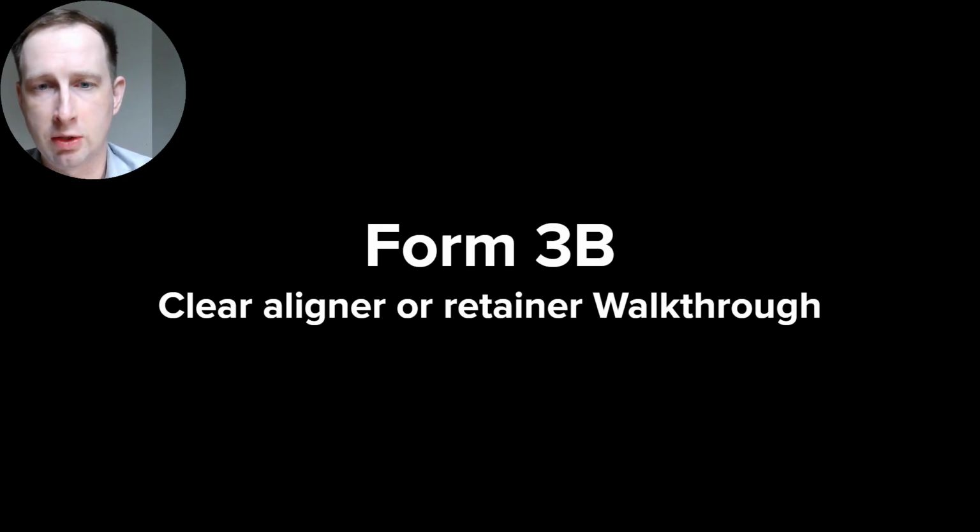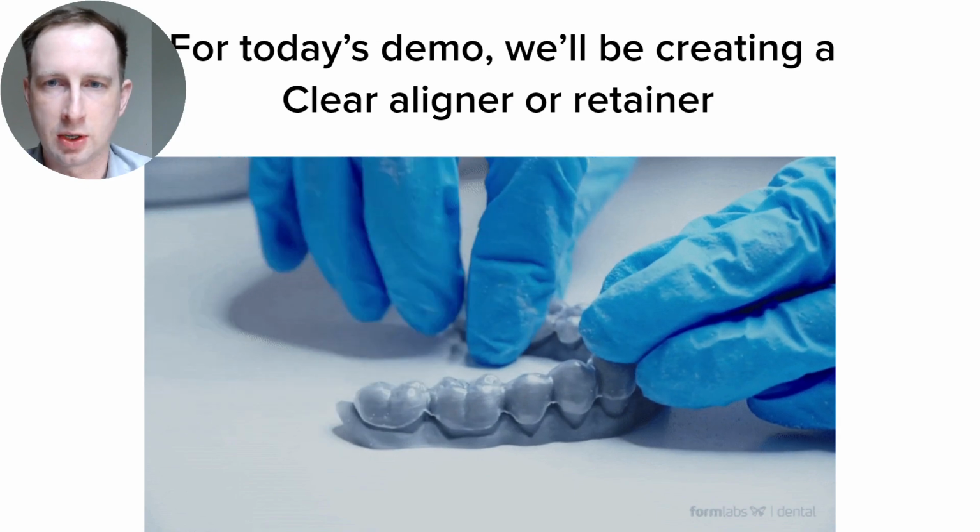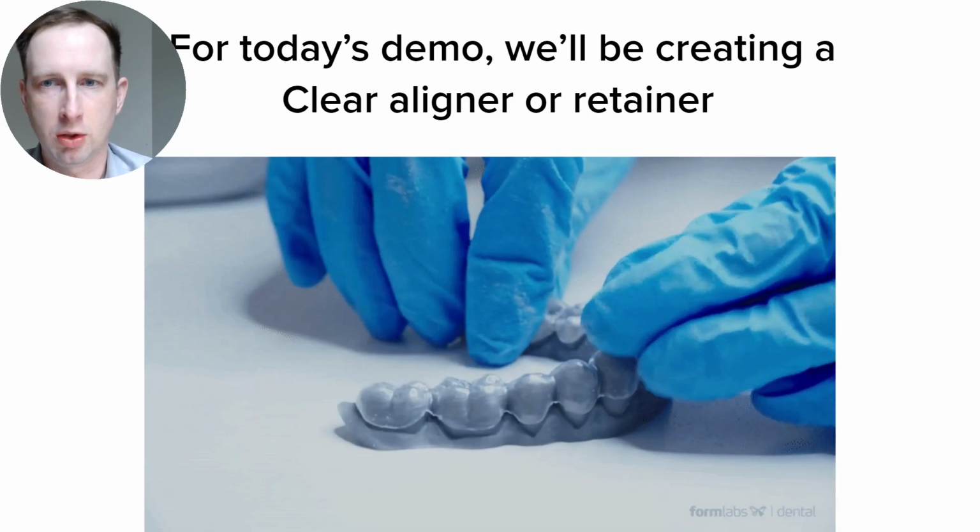So the Form 3B and then the clear retainer or aligner walkthrough basically has 5 major steps, including 3D printing and not. The blue arrows here are where we are very much a part of the process, but otherwise it starts with a 3D intraoral scan, so capturing a digital impression, taking those files, preparing them in a CAD software, which we'll get into a lot more detail on, printing those parts, finishing them, or washing and curing them, then forming them if we're talking about a thermoformed appliance, and then delivery or patient takes them home.